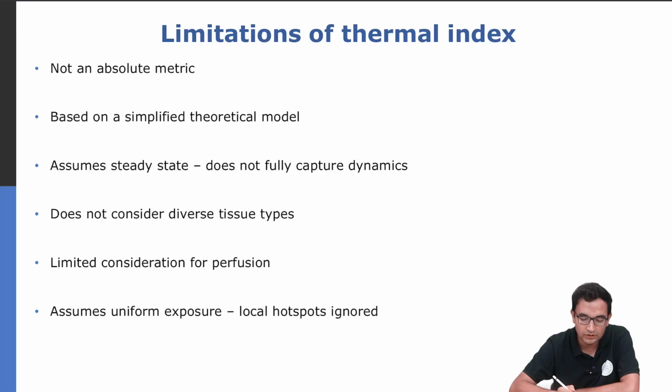It also assumes uniform exposure of the region of interest and ignores any local hotspots. So, that is something we should consider while interpreting the thermal index.